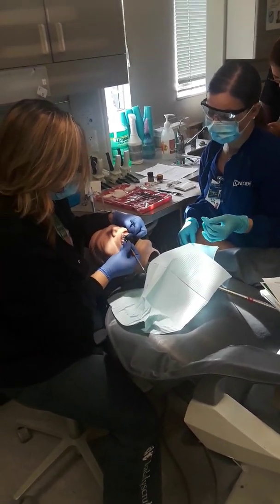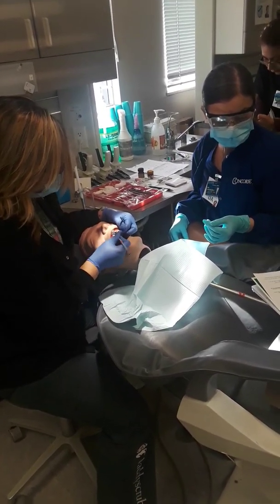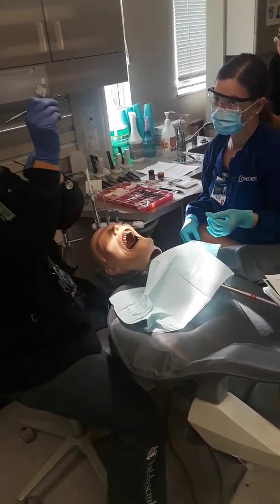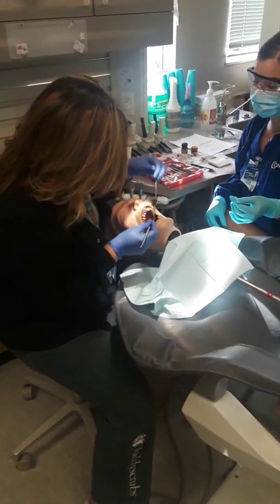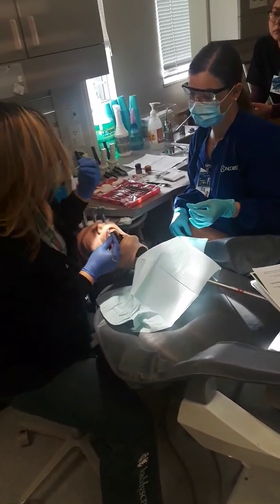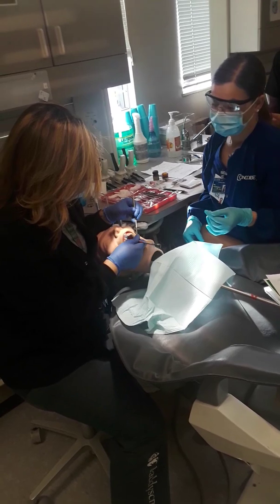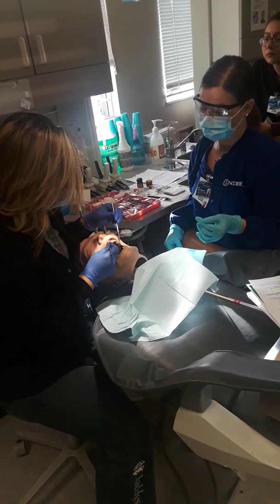So we're going to pack the cord all the way around the sulcus. The sulcus is the free gingiva area right closest to the tooth. And it looks like my sleeve, and so I'm basically packing it all in here. What does this do? Who can tell me what cord does? It stops bleeding and provides clear margins. Yeah, it provides clear margins so I can see during my final impression, because I just created my shoulder and the crown sits on the shoulder, so we need to make sure that crown that we're going to fabricate is going to sit directly on that shoulder and be flush with the edge of my shoulder.